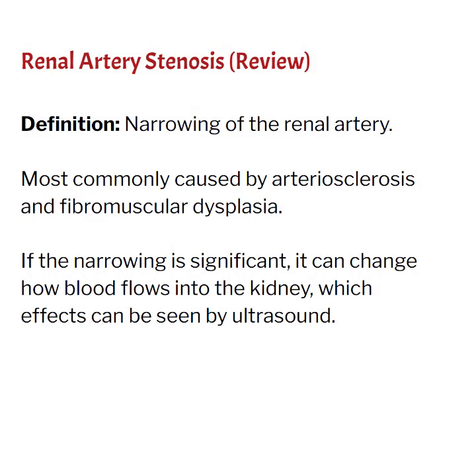As a general sonographer, you may or may not be required to perform renal artery stenosis exams. If you have a vascular ultrasound unit associated with your hospital, quite often the abdominal vascular work does go to the vascular unit. However, if you're scanning an abdomen for a multitude of reasons, you may come across kidneys that don't quite look right and resemble kidneys that are affected by a renal artery stenosis.